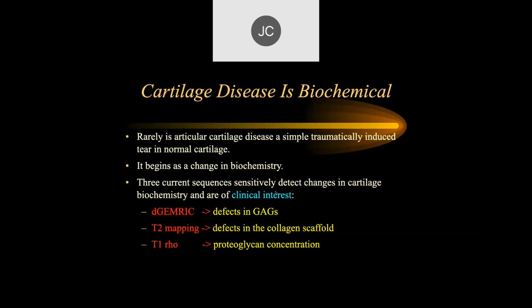Recently, I had someone from Hospital for Special Surgery in New York call me to ask if there was anyone out here that they could send patients to get dGEMRIC imaging. And I really couldn't find anyone in Southern California that does dGEMRIC imaging. This came out of Harvard, but we're going to talk about it anyway.